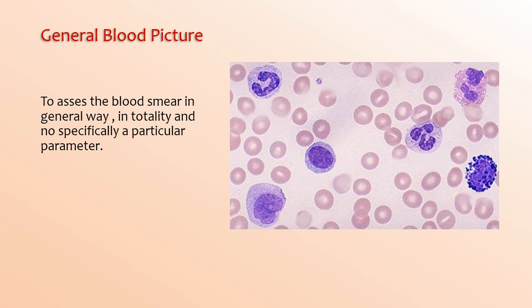Find an area where the red cells are evenly distributed. The normal picture is shown here — you can see there are red blood cells, white blood cells, and platelets. After the general look at the smear, you should start the review systematically. Later you will develop your own way. Examine the slide as per clinical requirement.